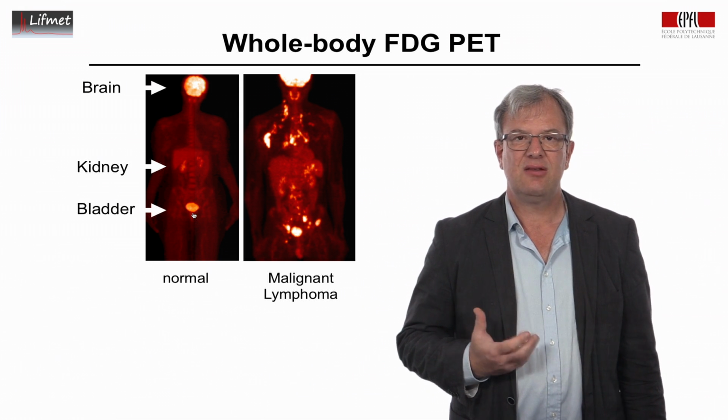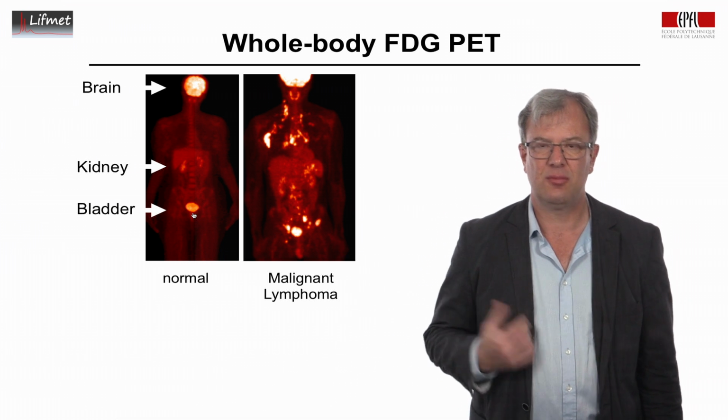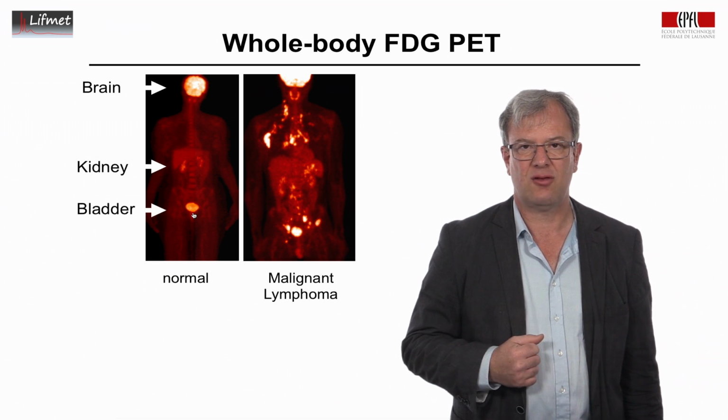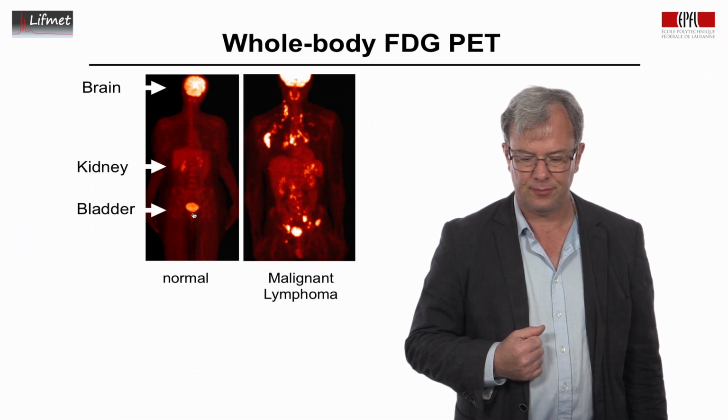So this ability to detect cancer in the body, to determine how many metastases the primary tumor has formed, is among the many reasons, but is a major reason why PET has become such an important clinical modality in practice.